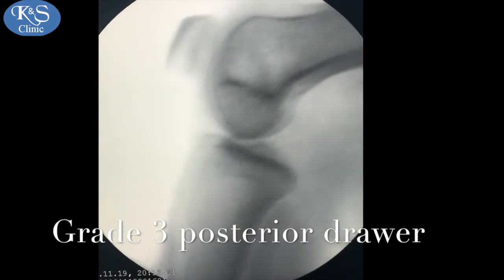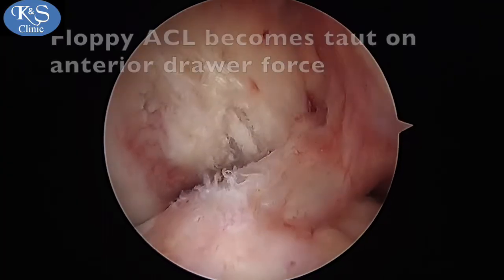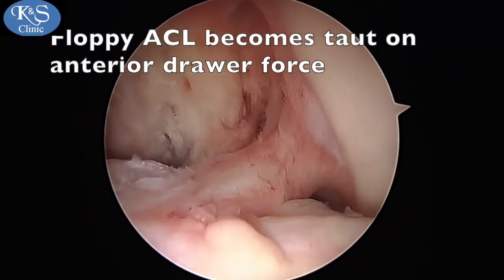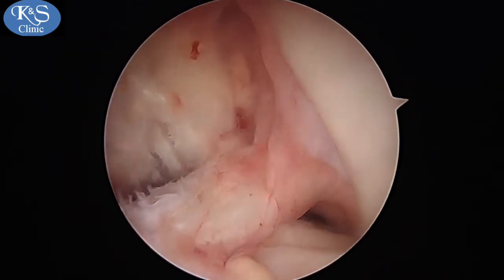The PCL tear can be seen on the MRI in the sagittal section, and the tibia can be translated so much posteriorly on a stress x-ray, indicating a PCL tear.